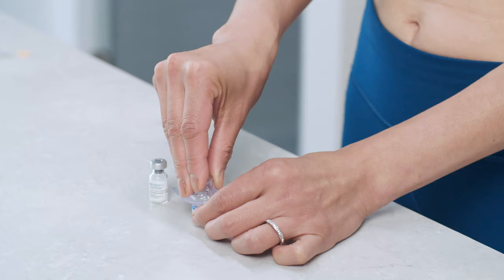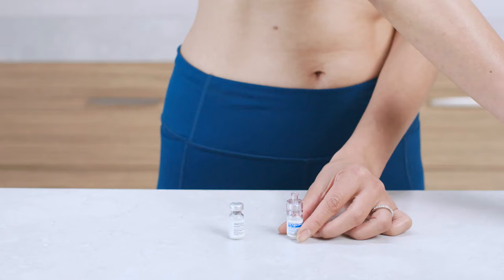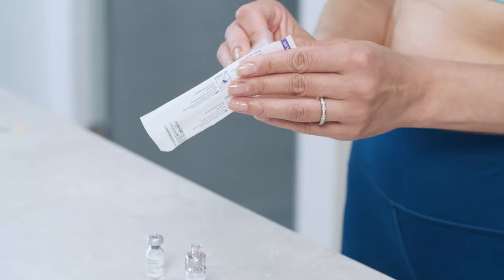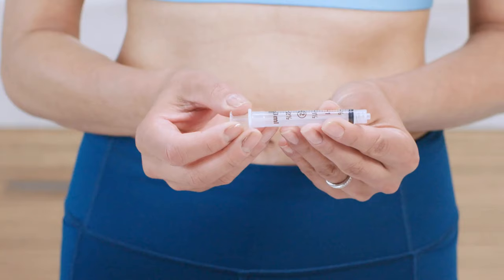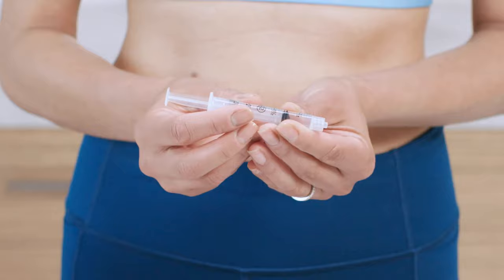Push the spiked end straight down through the rubber stopper and into the vial until it snaps into place. If the Q-Cap falls out of its package, toss it and use a new one. Once the Q-Cap is securely in place, go ahead and remove its packaging and toss it in the trash. Be careful not to touch the connector end of the Q-Cap. Next, you'll draw air into the syringe, so pull back the plunger to the amount of diluent your healthcare provider has recommended, usually 1 CC or 1 ML.